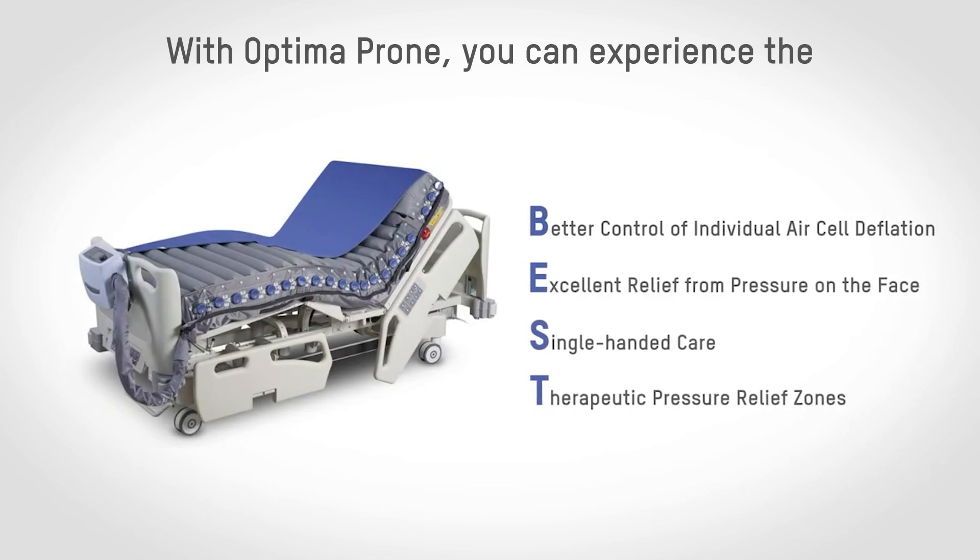With Optima Prone you can experience the BEST: better control of individual air cell deflation, excellent relief from pressure on the face, single-handed care, and therapeutic pressure relief zones.